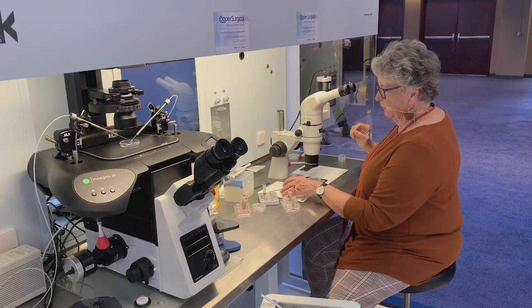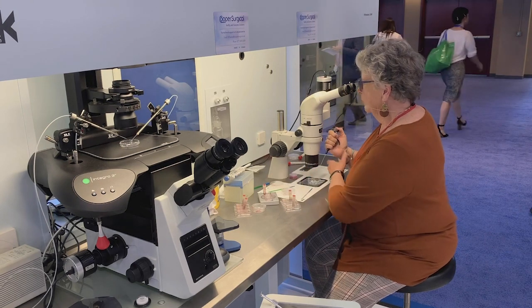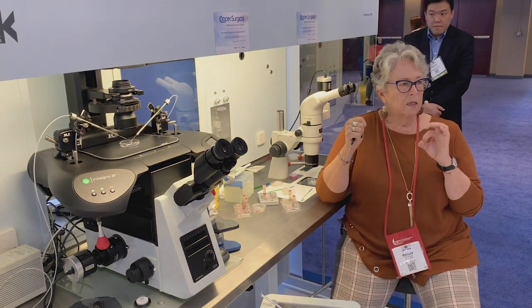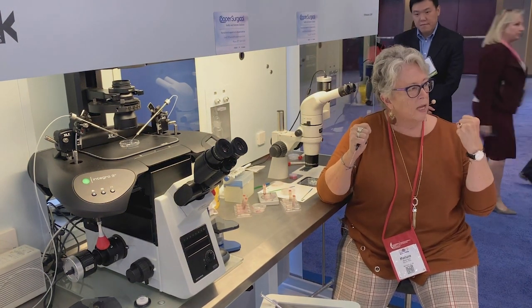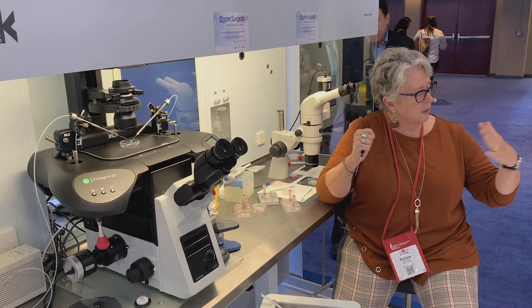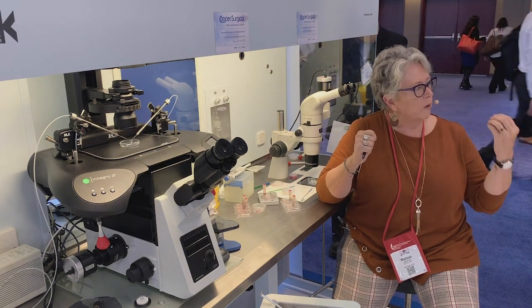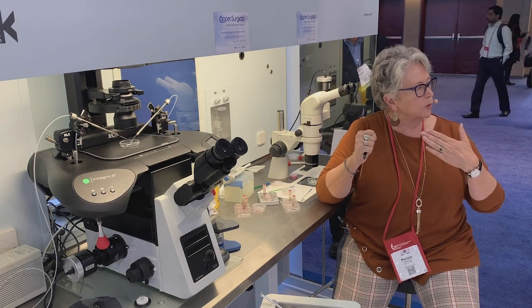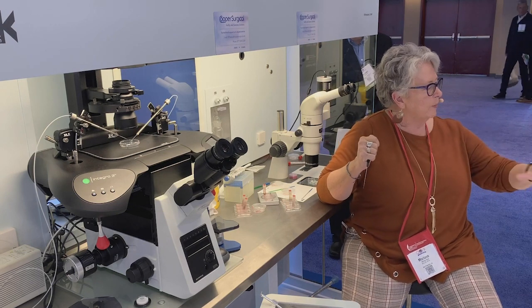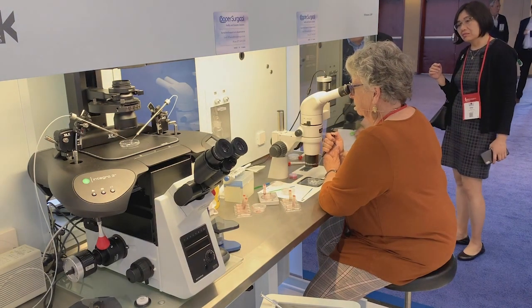So for any of you who have done vitrification, it's pretty straightforward. So we've got the blue beads here. One of the other things that I think is really key is that you not have your focus so tight that all you can see is your embryo. You can't see where it is in the dish. You want to be far enough back to be able to actually visualize your embryo, pick it up easily, know where it is in your stripper tip and where it goes into the next drop. So you don't want to be tight, tight, tight. You want to be back a bit. So at this point, I'm just picking up a blue bead.